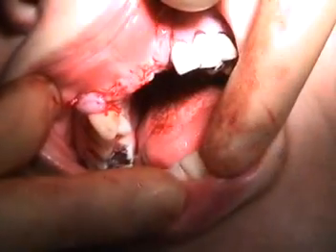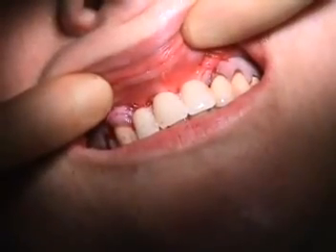The surgical site is now closed using Vicryl sutures and the suitably adjusted temporary denture refitted.